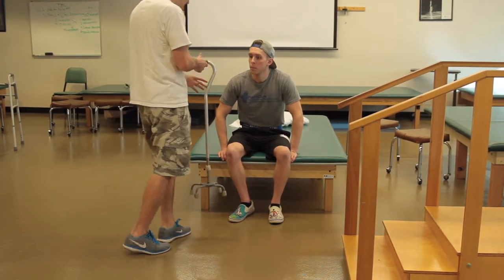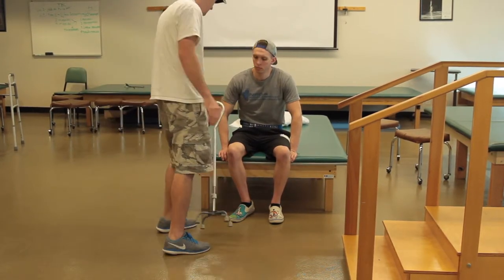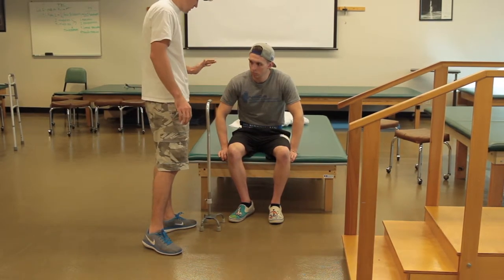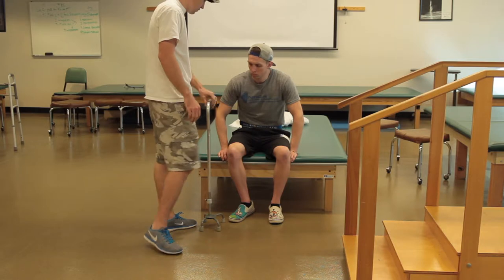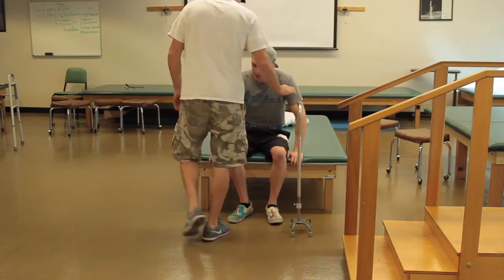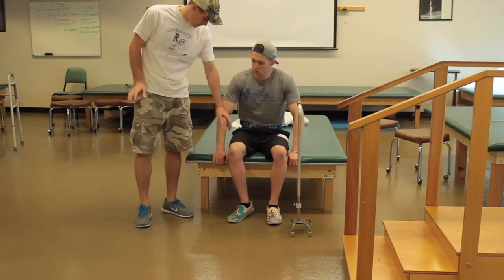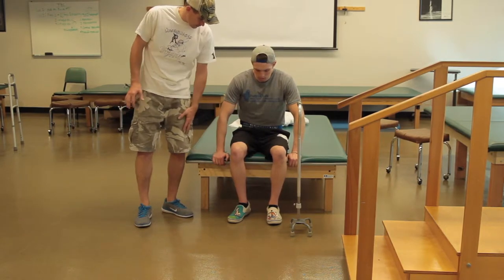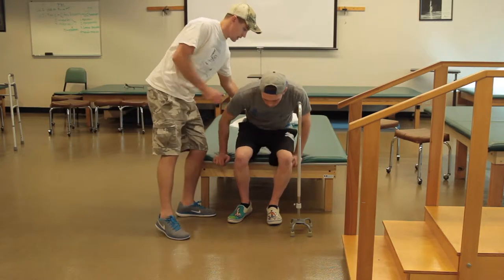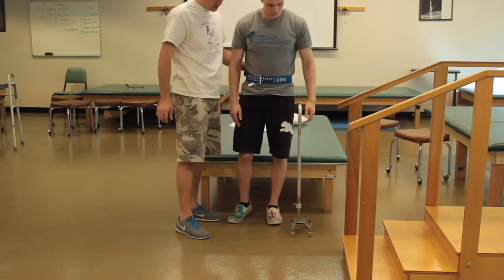So let's go ahead and do that. In order to stand up, an easy way that you can do that, where this is a quad-based cane, you can just let it sit right there, ready for you to go. Sit on the right side. Okay, so just push up with my hands here? Yep, so use your hands to push up. You can use the side where there's less pain to put more of your weight on. You go ahead and stand up. Good, so grab that cane there.